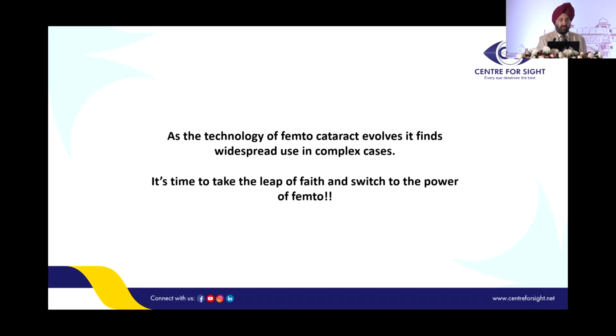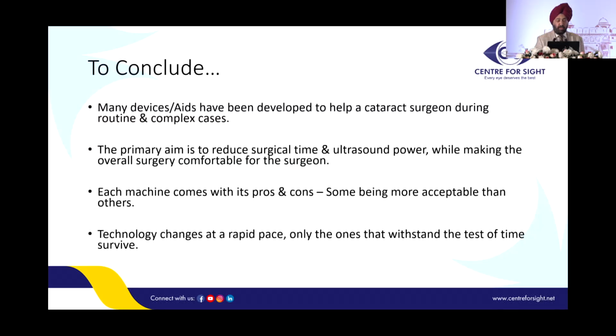So this is all that I would wish to say, that femto is a tool that helps the most in complex cases. And to conclude, many devices and aids are also there which help develop the cataract surgeon during these complex cases apart from the femto. And the primary aim is to reduce the surgical stress and the time, and to reduce the ultrasound power and to give better outcomes. And each machine comes with pros and cons. The most difficult thing in the femto is to maintain and to buy a femto. But technology is changing at a rapid pace, and the ones that withstand the test of time will survive. And I think femto, which is now 15 to 20 years old, is a technology that is there to stay.